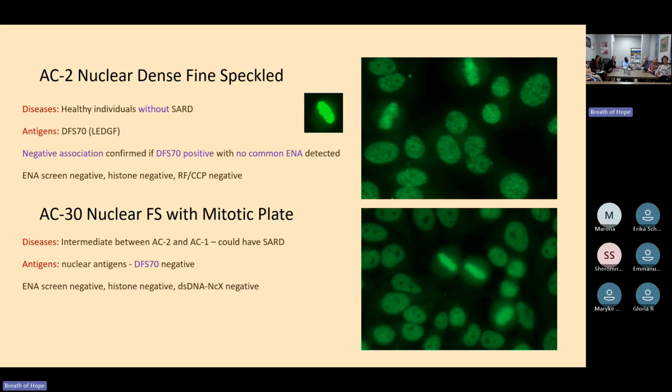plate is different from this is a homogeneous one. Nuclear homogeneous over there. It's more solid, and they describe it as having a hyaline appearance. This one is more speckly, and you can also see that you don't have that lovely smooth look that we had with a homogeneous.